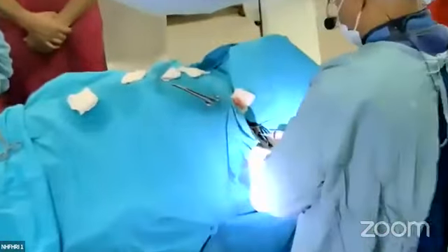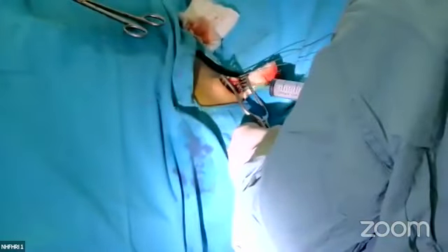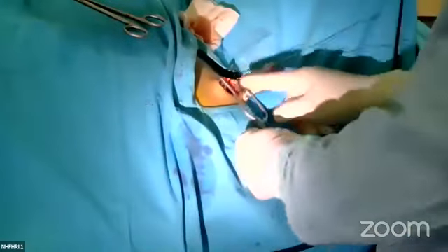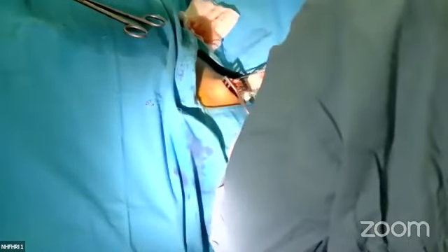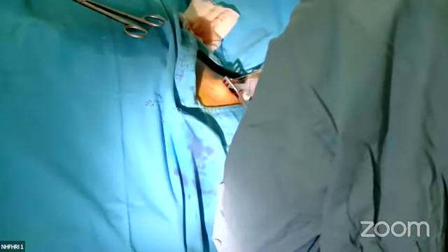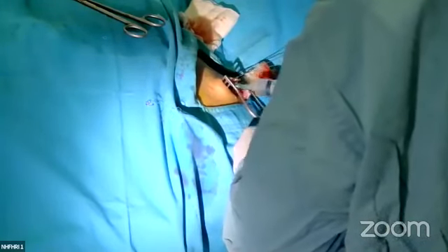Yes, so this is the incision. Now I am making the pocket, more local please. The incision is around 2 to 3 centimeters, depending on the size of the device. For a dual chamber pacemaker, it is a small device. If it is an ICD or CRT-D, the incision should be more liberal, bigger.